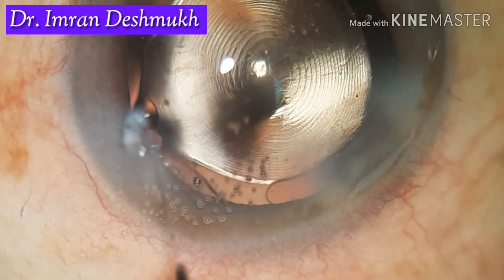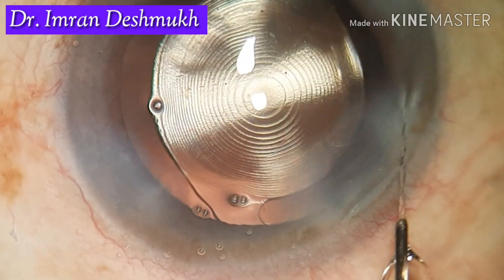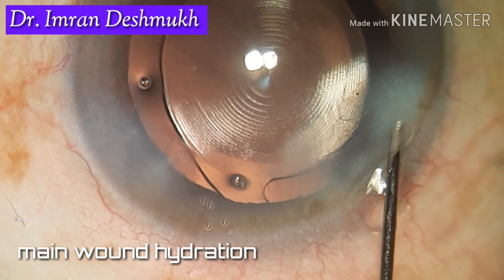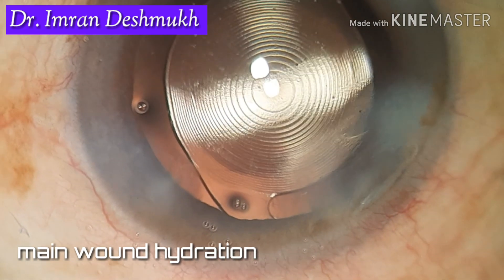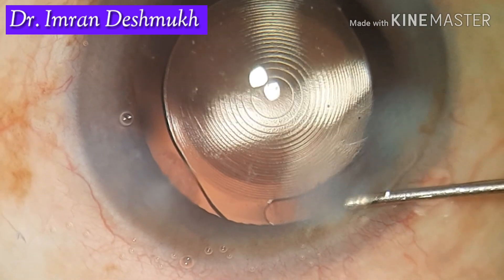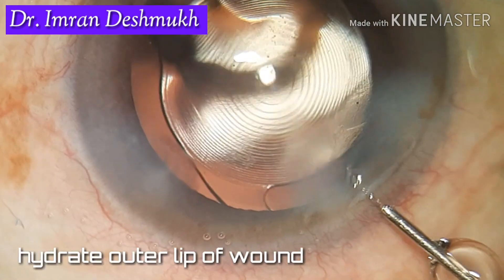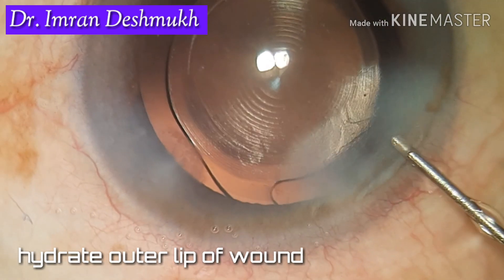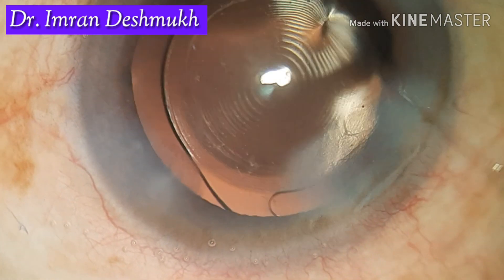The hydration should be in the mid-stromal region. Once the side ports are hydrated, go to the main port and hydrate in the mid-stromal region on one side of the main wound, then go to the other side and hydrate the mid-stromal region there as well.